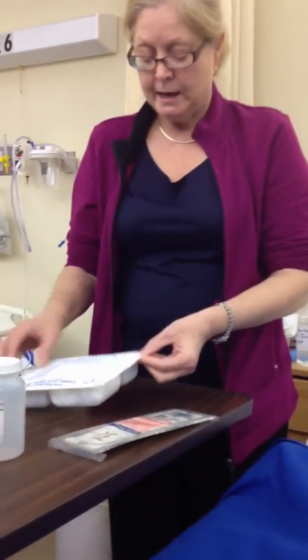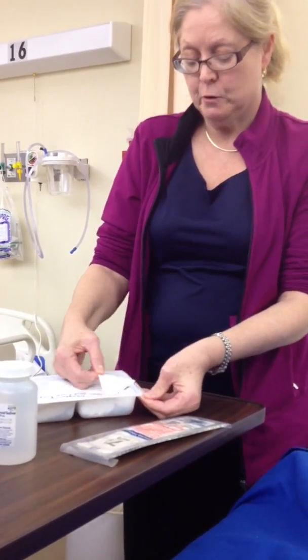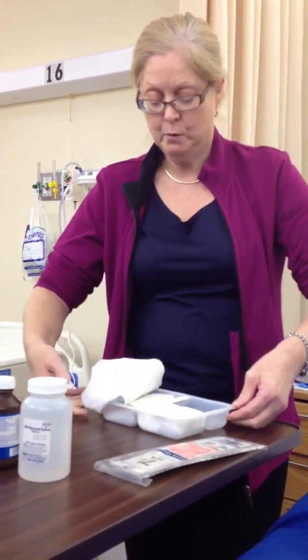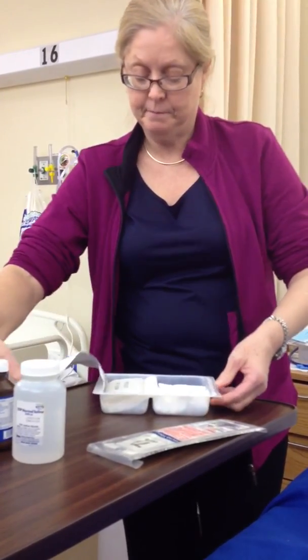Okay. And I'm going to go ahead and open my kit. So it's got the little label right here to open. Oh, and it does have gloves, I think. Yeah, we got gloves. Okay. So I'm going to leave my kit open here.